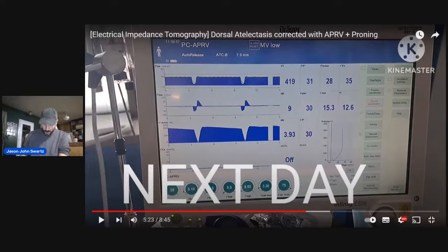You also said right about the docs. Most are not always too sure. Yeah. The only reason that we use APRV in our ICU is because of the PulmoVista 500. I started to do that, the PulmoVista, and then the APRV.